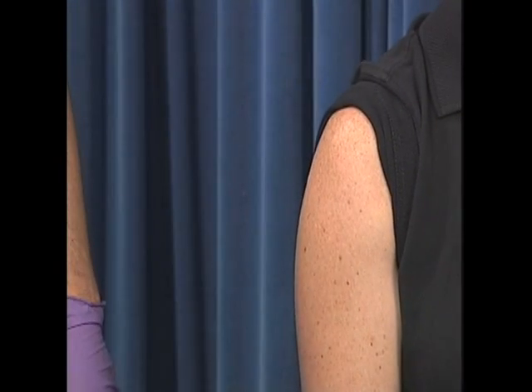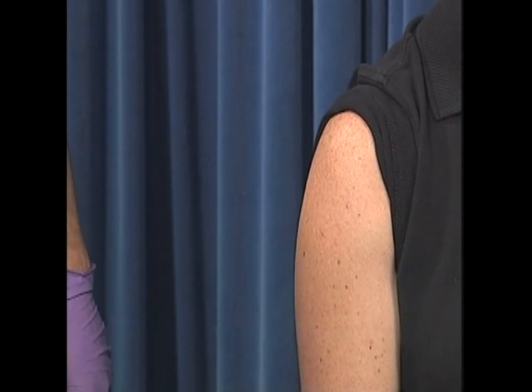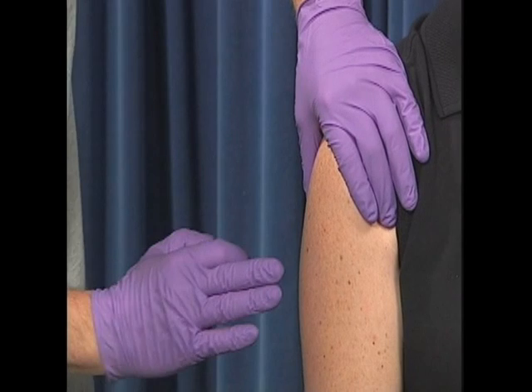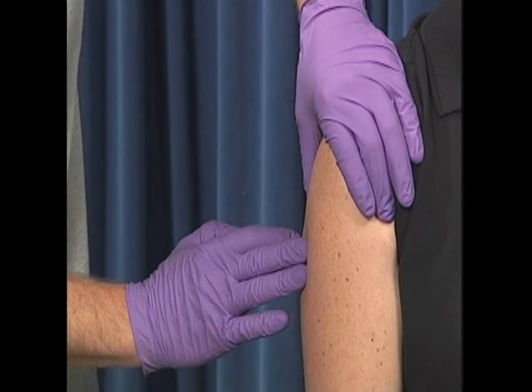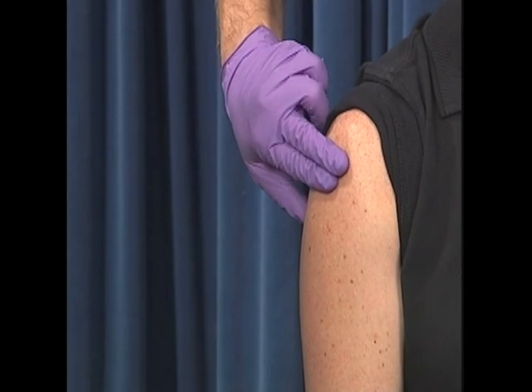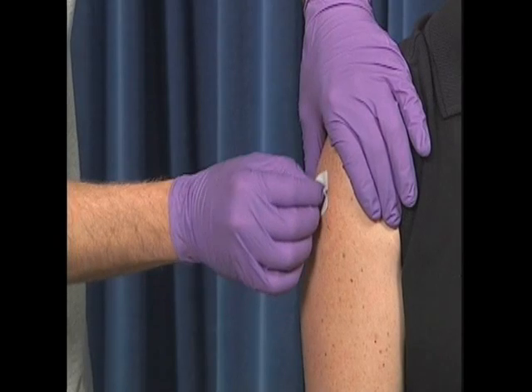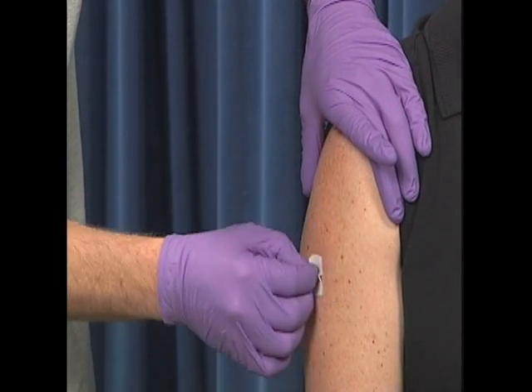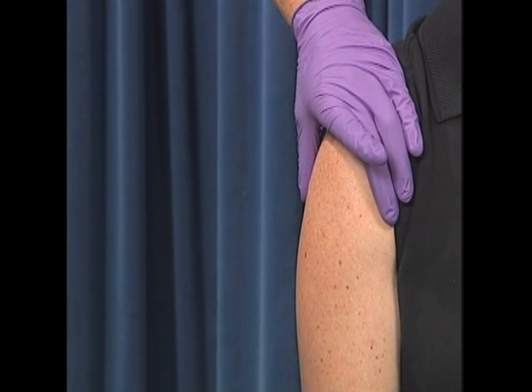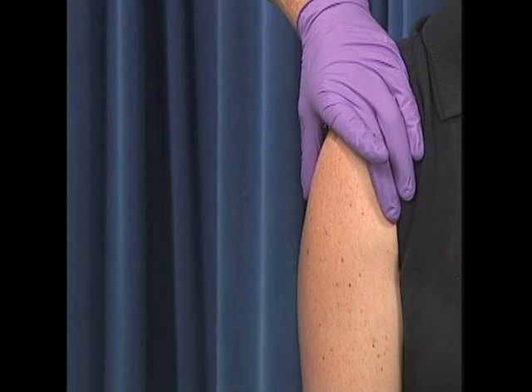When intervening with an intramuscular injection, always make sure to recheck the medication for the patient rights. Select an injection site, either the deltoid or vastus lateralis due to accessibility. Cleanse the injection site with an alcohol prep or another suitable antiseptic swab in an outward circular motion for about 2 inches. Allow the swab spot to dry for approximately 30 seconds for bacteria to be killed and to minimize discomfort of the injection.